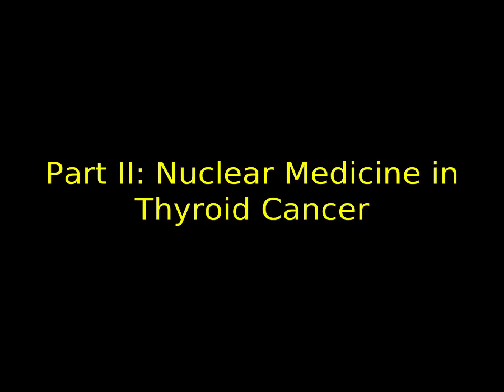Hello, and welcome to part 2 of nuclear medicine thyroid scintigraphy. So today we're going to talk about nuclear medicine in thyroid cancer, and I'm going to divide our discussion on thyroid cancer into two parts. Today we'll talk about the various types of malignant disease which are encountered in the thyroid gland, and we'll also discuss how scintigraphy can be used in the evaluation of these. And in the next talk, we'll go through quite a lot of images and discuss the findings at scintigraphy.